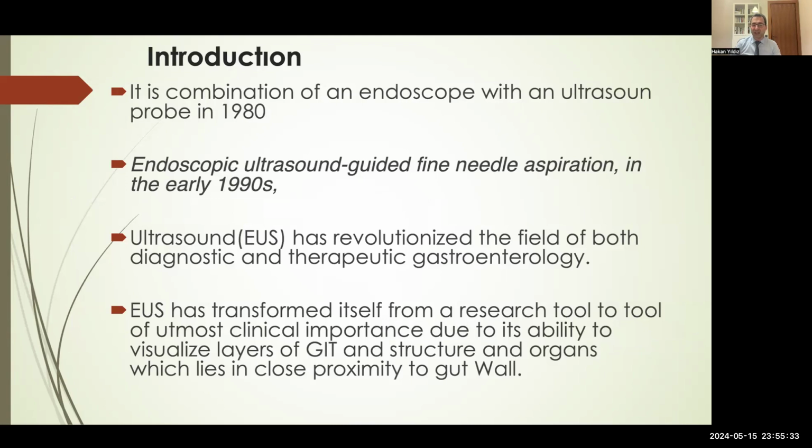The combination of an endoscope with an ultrasound probe in 1980, and endoscopic ultrasound guided fine needle aspiration in the early 1990s, has revolutionized the field of both diagnostic and therapeutic gastroenterology. It has transformed from a research tool to a tool of utmost clinical importance due to its ability to visualize the layers of the gastrointestinal tract and structures and organs which lie in close proximity to the gut wall.